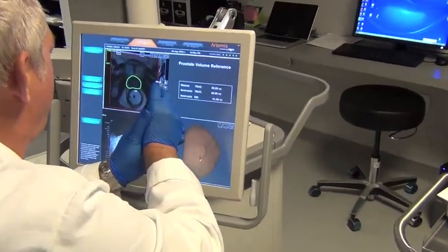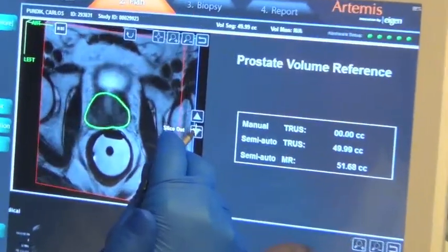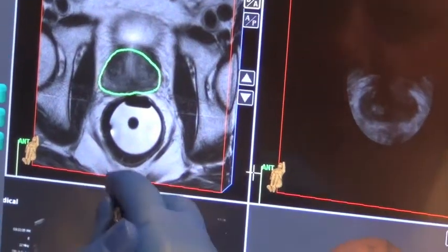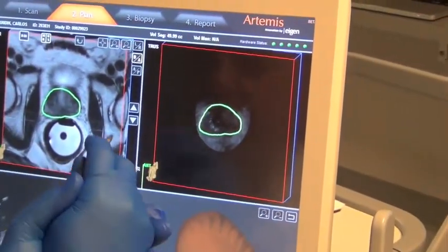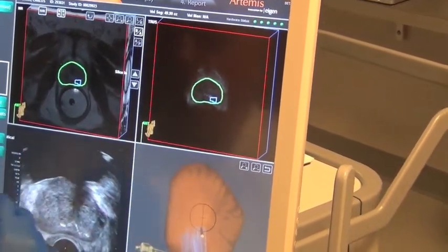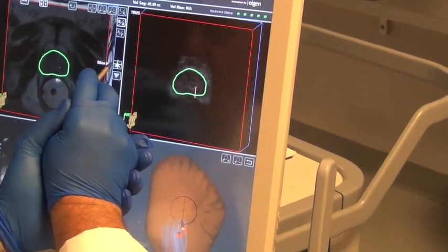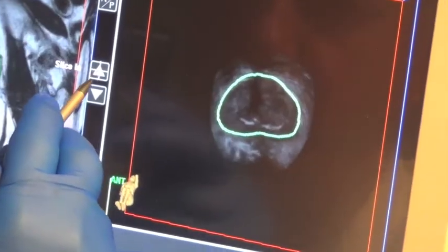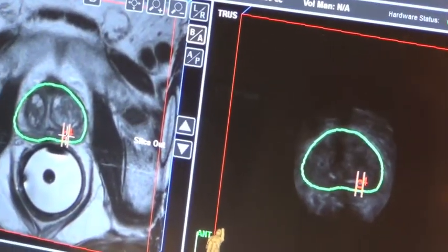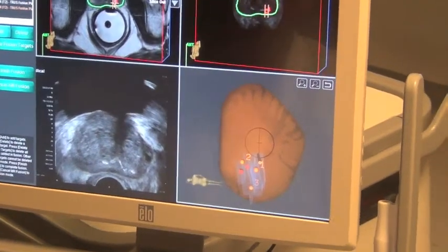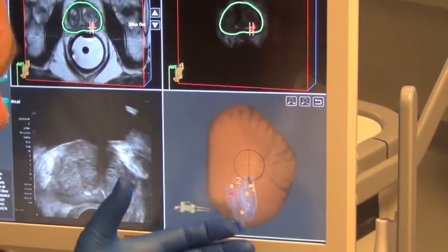A very nice MRI image on the screen. Now we're going to globally align — we're going to align the ultrasound and the MRI images with the software and be sure that these images correspond to each other. Now we're going to fuse the images. The computer has now done what's called a fusion — it's done this precise overlay. Now we see the areas that I've identified as abnormal. Now we're going to put the targets in; it's all done by computer. We can see that we have a number of targets laid right into the MRI region of suspicion.